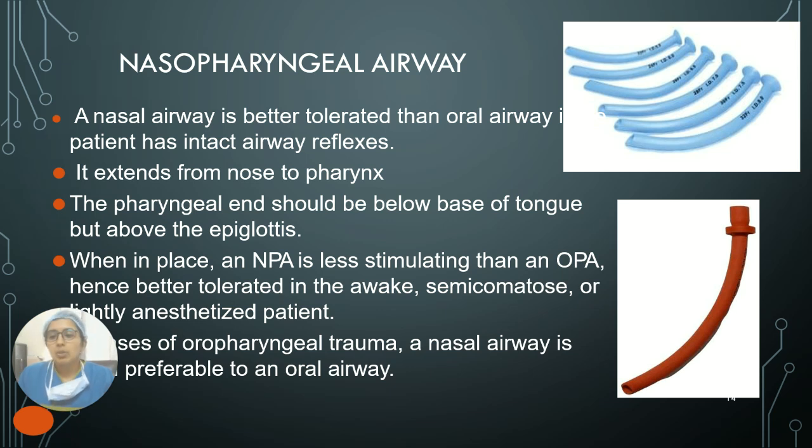It should be avoided in cases of oropharyngeal trauma. In cases of oropharyngeal trauma, a nasal airway is preferred to an oral airway.